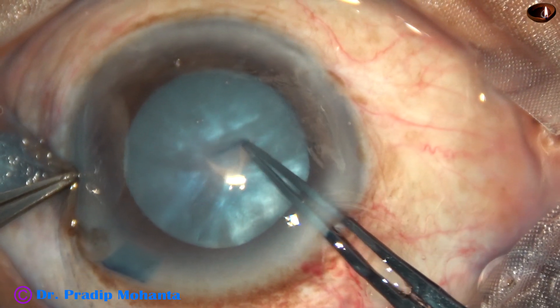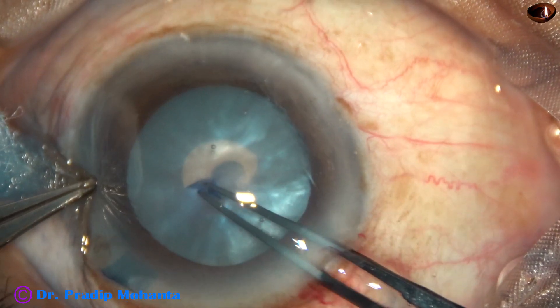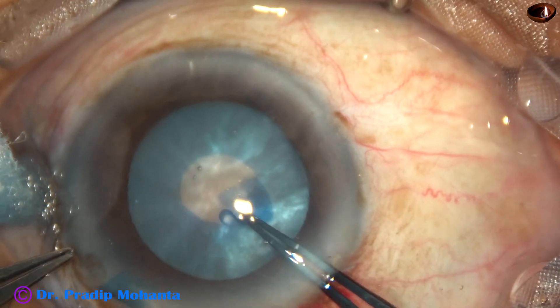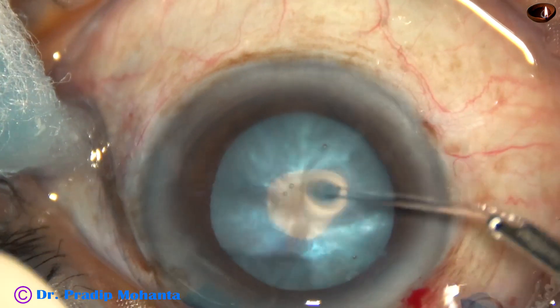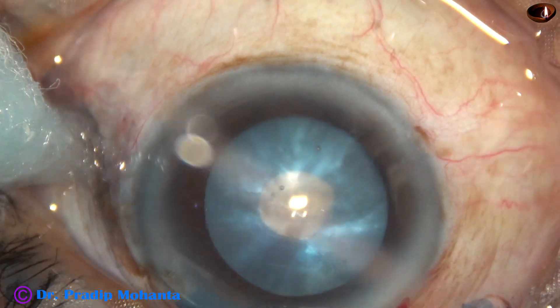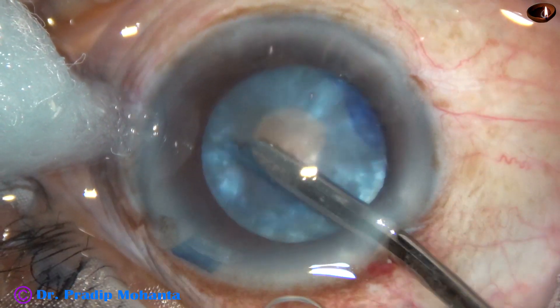Now I use a utrata forceps to move this tag all around and do a small rhexis at this stage. If I try to do a large rhexis, invariably the rhexis will run to the periphery and get lost under the iris. The intra-lenticular pressure will be reduced by these procedures.